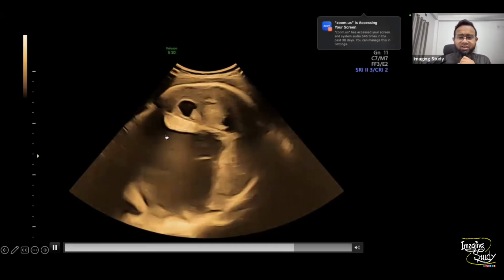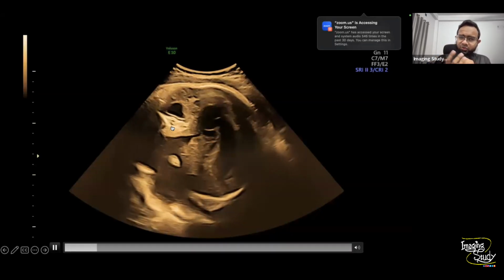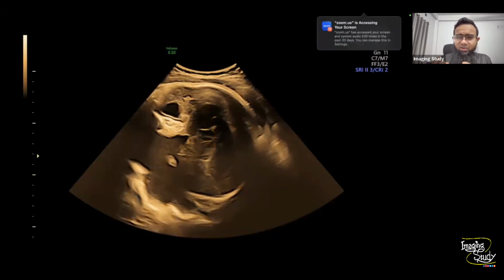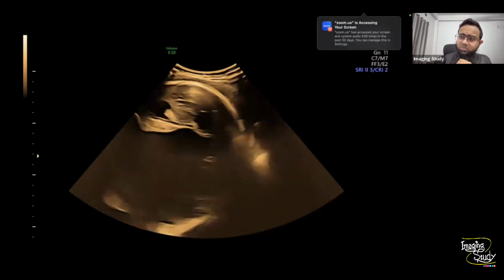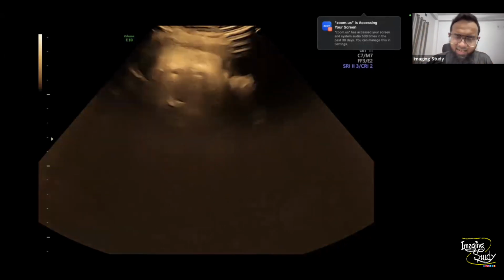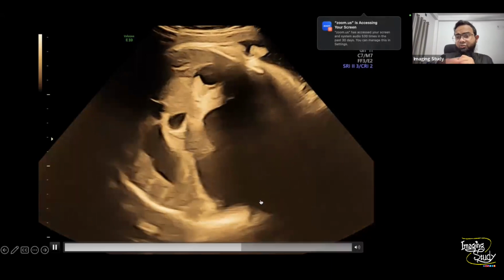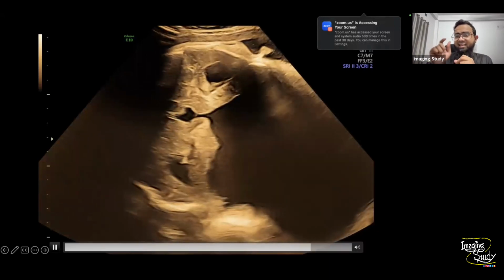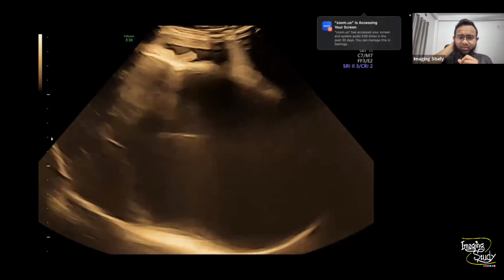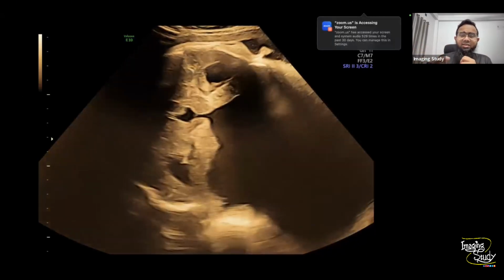So definitely this hypoplastic or thin cerebellum with a posterior fossa cyst, and communication of the posterior fossa cyst with the fourth ventricle, indicates this is a case of Dandy-Walker malformation. I have never seen this type of huge cystic dilatation of this part. So, a huge-sized cystic area. I searched the whole spine to see any obstruction, but the spine looks quite normal in this patient. Though the examination was not very satisfactory because the amniotic fluid index was around 8.